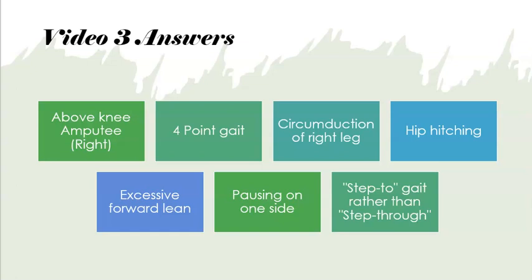So here, it's so difficult for them to get that proprioceptive feedback, because remember that the bottom of the stump now becomes the foot, and if that's the mid shaft of your femur, it's going to be much harder to almost guess where the foot will be, because you get less feedback through what's going on. So it's a real skill of learning how to walk again, very genuinely.